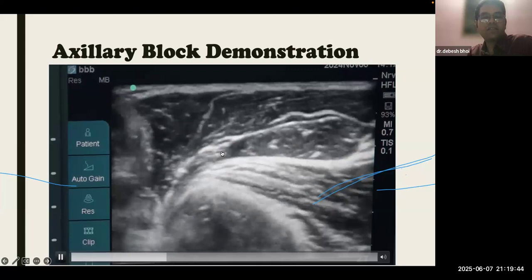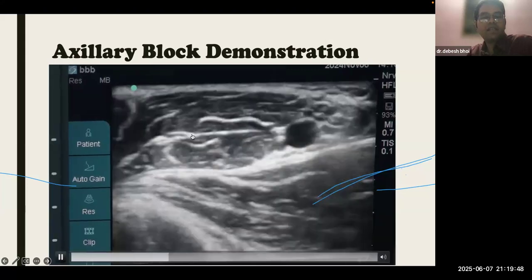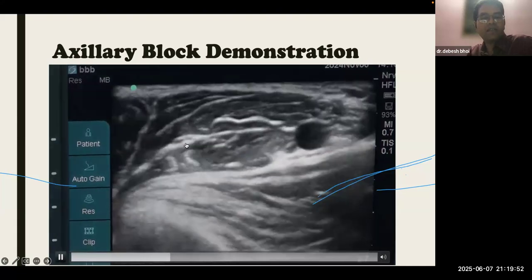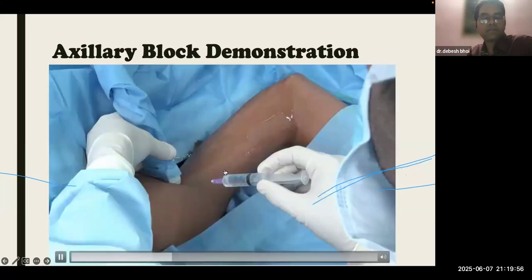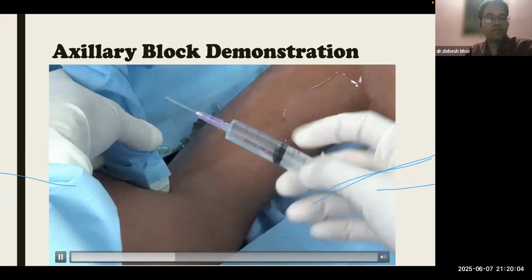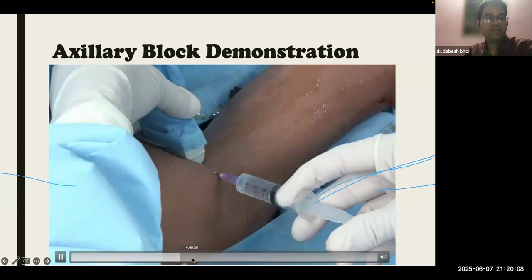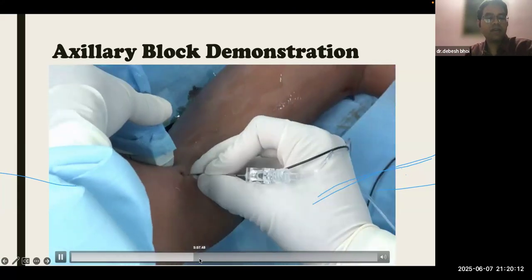This is the musculocutaneous nerve that is sandwiched between the coracobrachialis and the biceps. It is more lateral, so it can be identified lateral to the artery. Also, there is variation; it can be close to the plexus. We'll do it just at the top of the musculocutaneous nerve so that you can reach in both directions. So now, just after giving local, what we have to do? A small injection, so that the patient will tolerate it well, and the echogenic needle you are using for that.